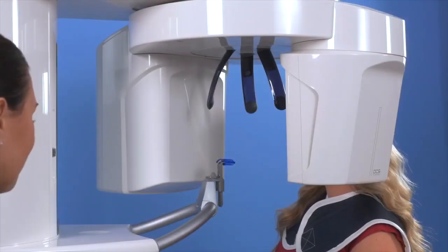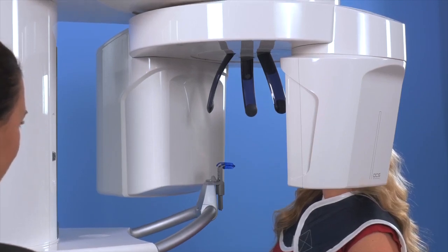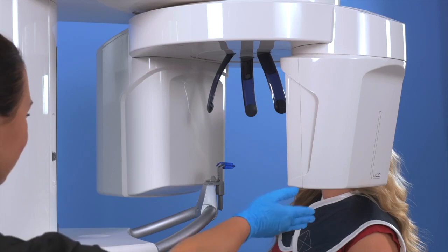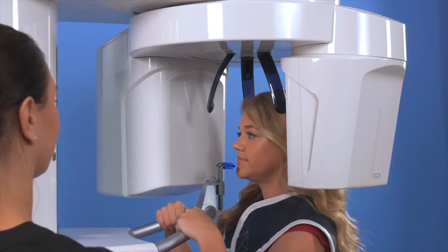With our patient just outside the machine, we will get the machine close to the final position for the patient. Bring our patient in close to the bite stick. Have the patient hold onto the bars and get comfortably positioned.